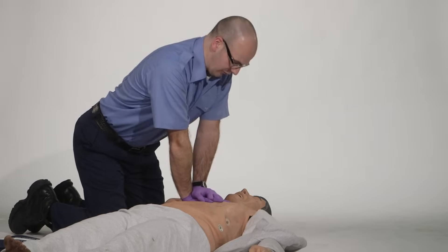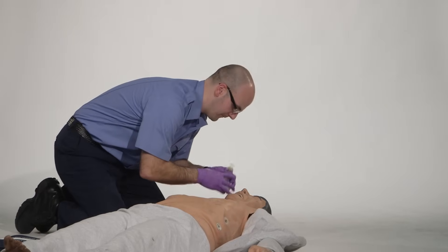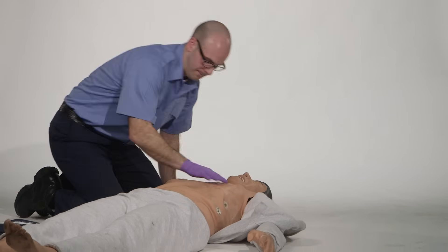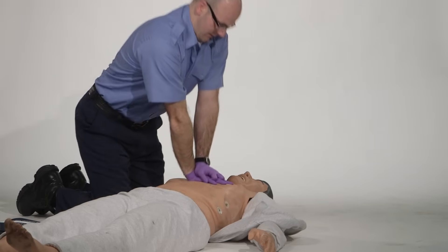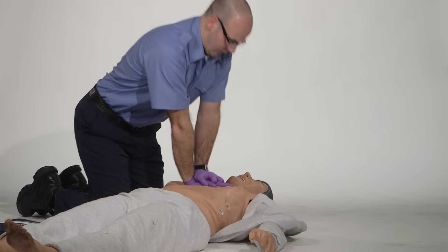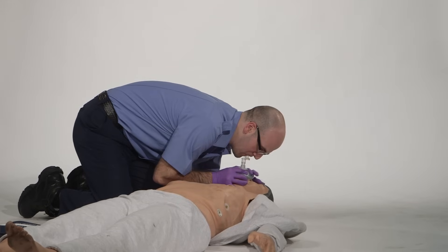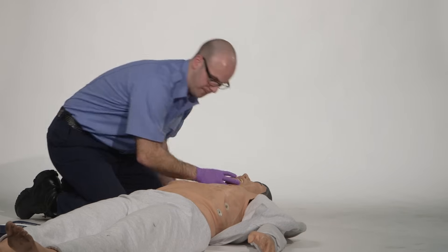Candidate performs chest compressions, counting aloud through multiple sets of 30 compressions, maintaining rhythm and rate throughout the cycles.